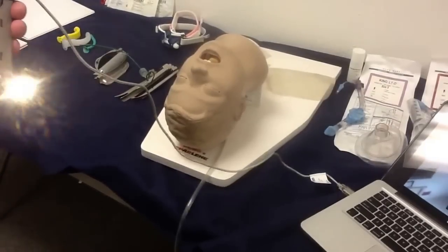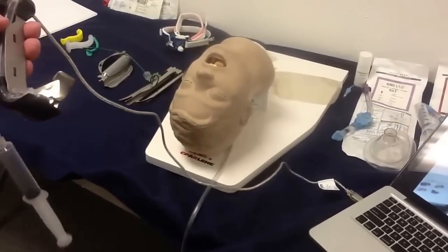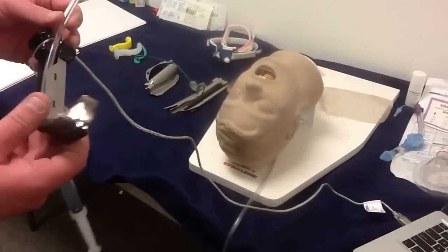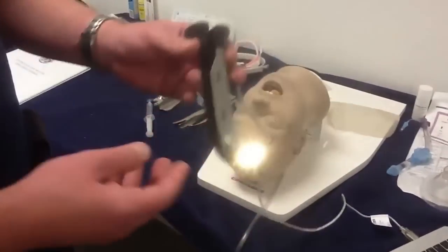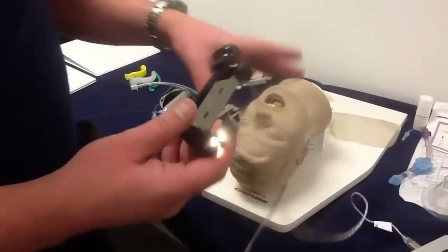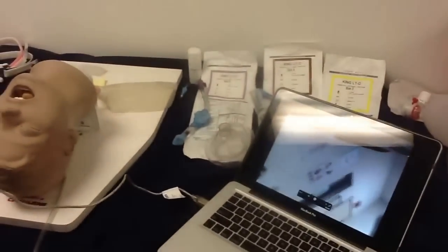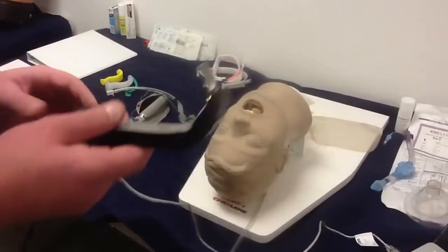I wanted to show you guys a product that somebody gave me the other day to demo, test around, and train with. It's called Vivitrac — they're out of Palo Alto. It's a $60 disposable, single-use, USB-capable device that has a camera in it. It plugs into any computer and can be imported into your documentation for intubation success.